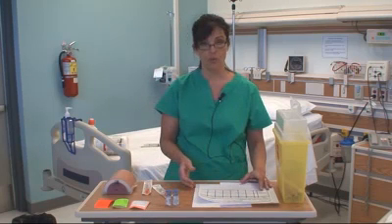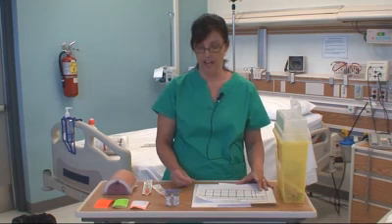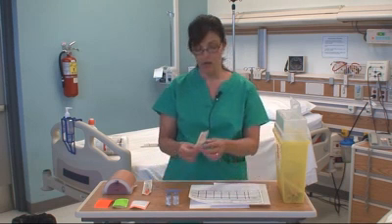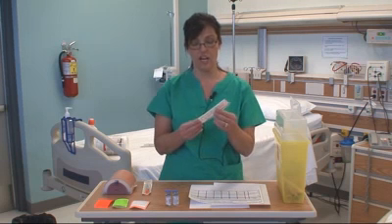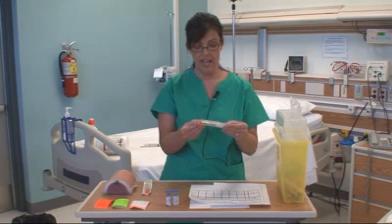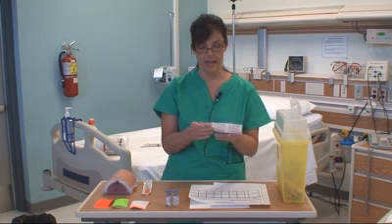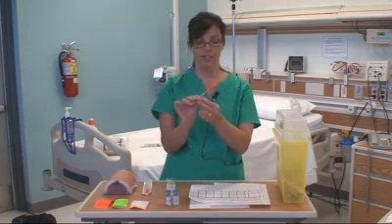Some clients actually have their own insulin pens, and they are very easy to use. They come with a little cartridge, and the client just dials that dose in. But in this situation, we're using the hospital stock. We also need to make sure that we get the insulin syringe, and this syringe actually comes equipped with a needle. The needle is a 1/2-inch needle, and the difference between the insulin syringe and the other syringes is that the insulin syringe is measured in units as opposed to milliliters. So this is actually 100 units as well.